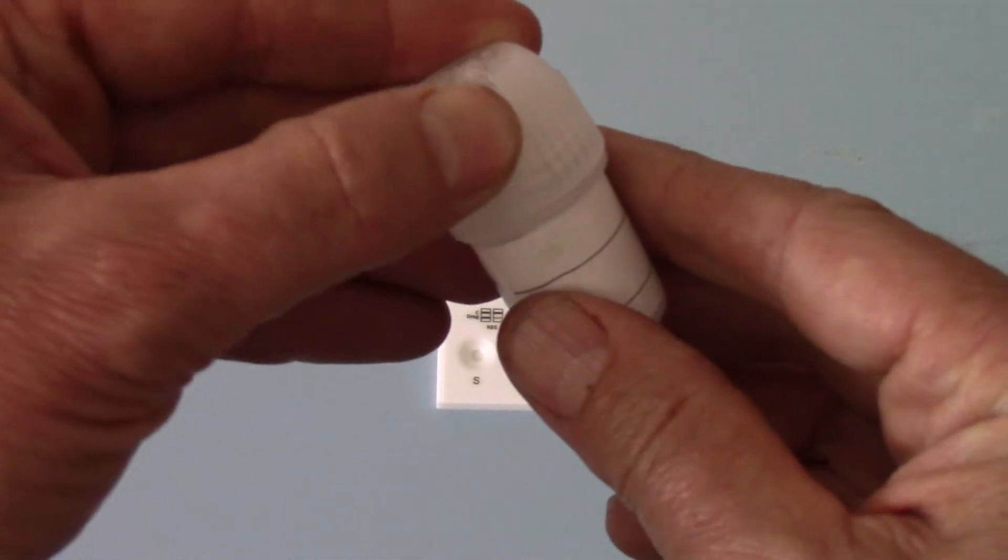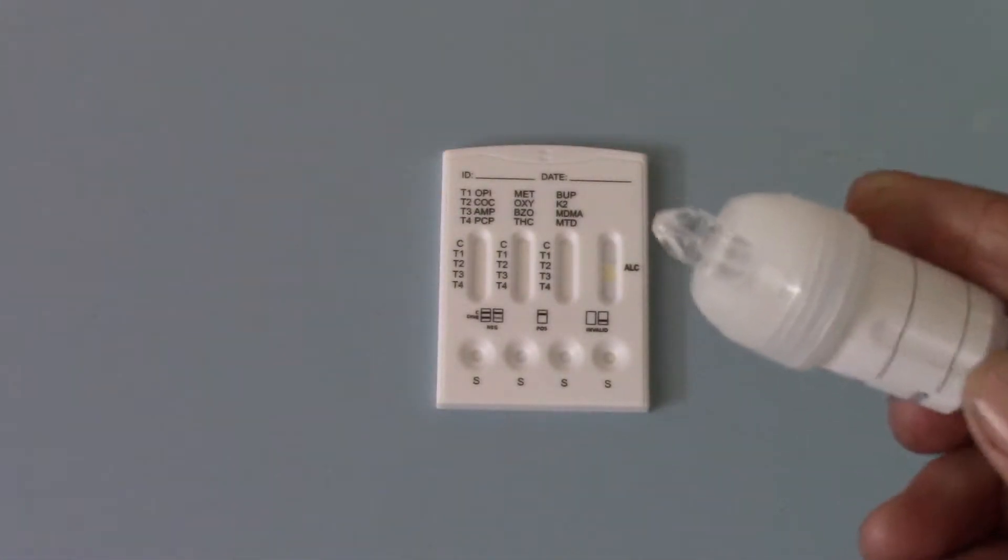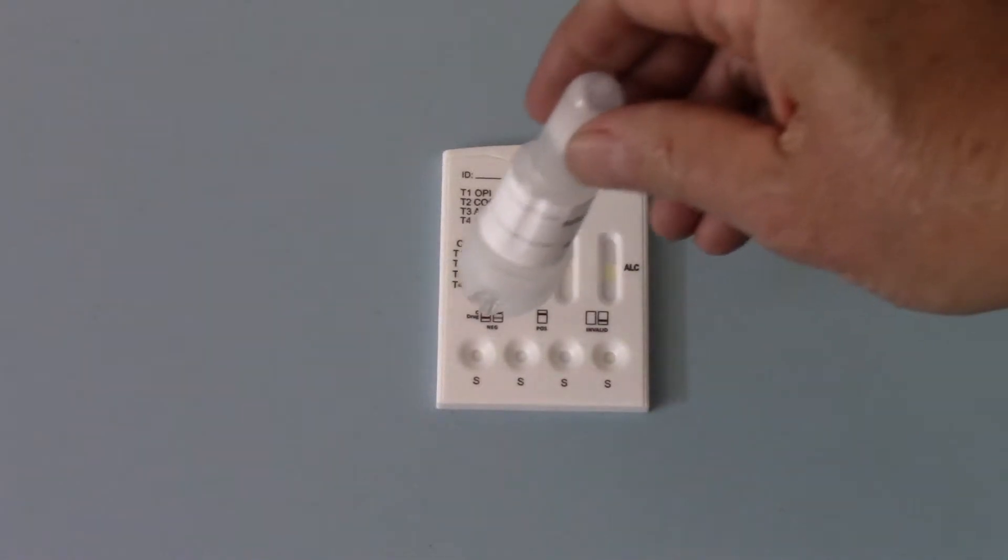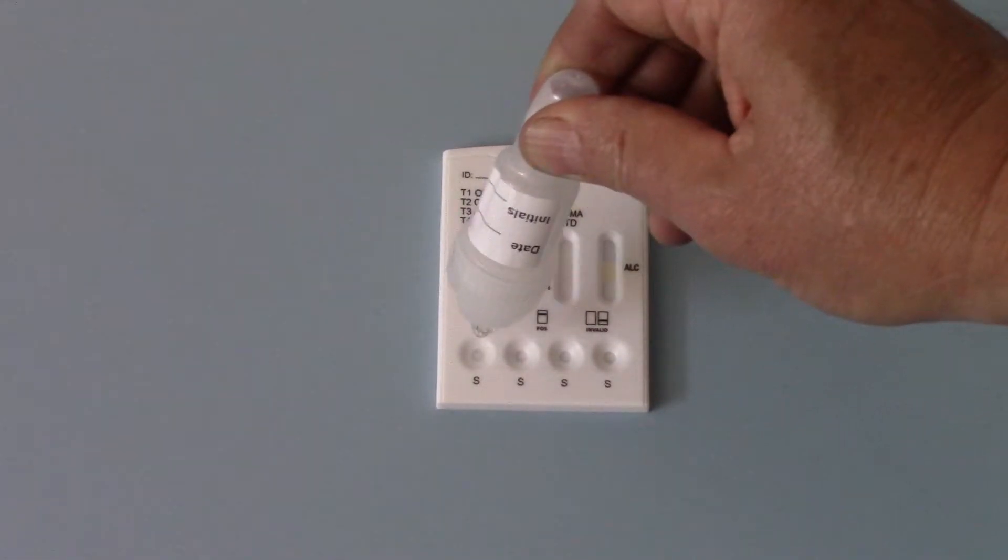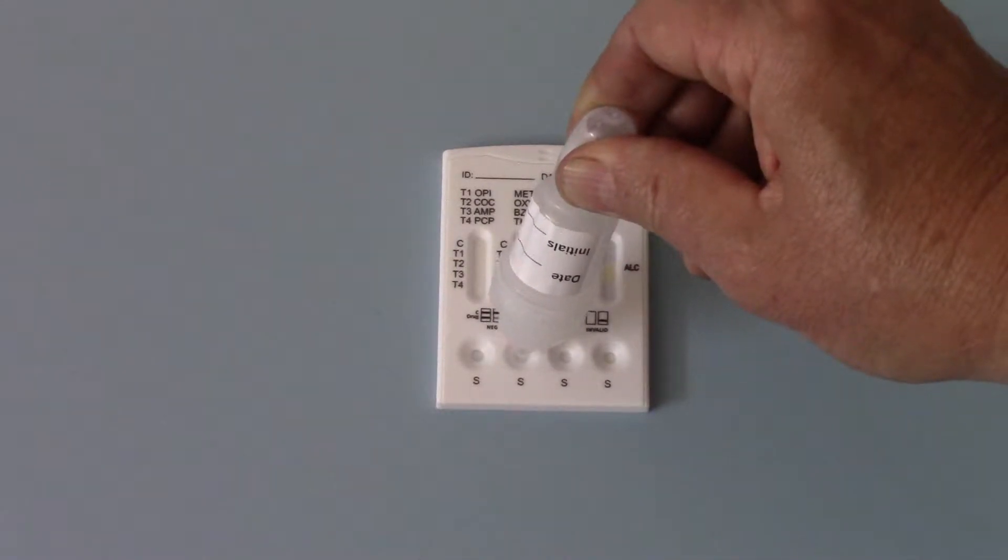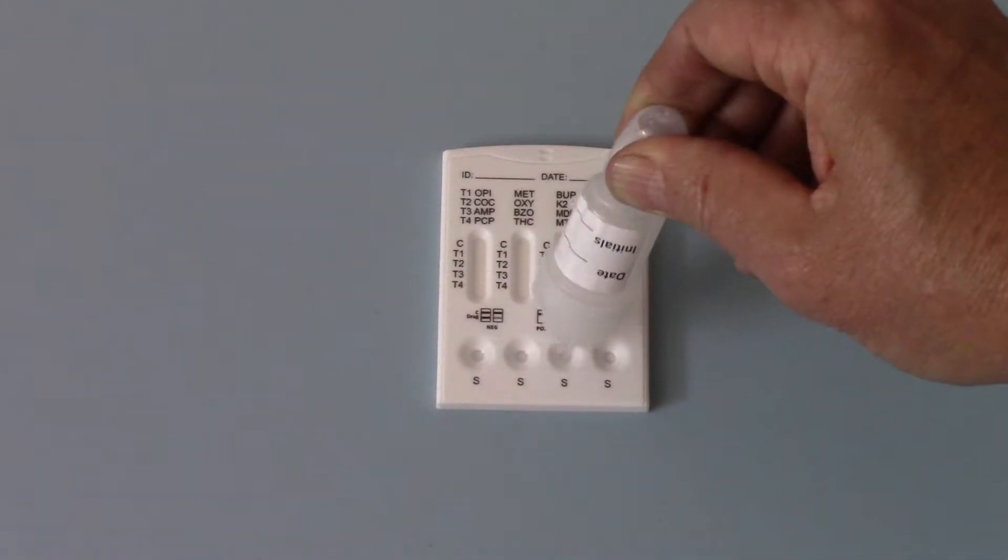I've come round the other side now. We invert the dispenser and then what I'm doing is just squeezing this and adding two to three drops of saliva into each of these sample wells.